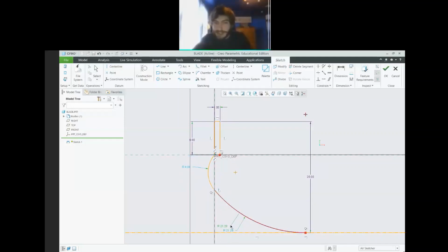With more rigid designs, we would have all the dimensions, we would know everything. But for our purposes, especially when dealing with animals, close enough is about the best we can get. You can't force an animal to sit down and take every measurement you could possibly want. It's just not going to happen. They're going to be moving. You're going to get as close as you can get to what you want. And so here we can decide how we want this to look by eye.